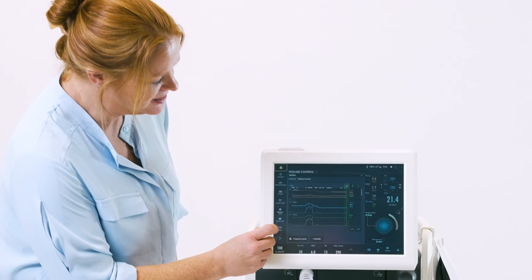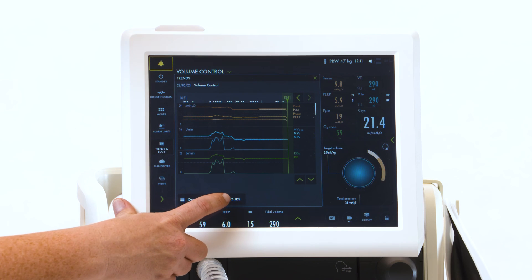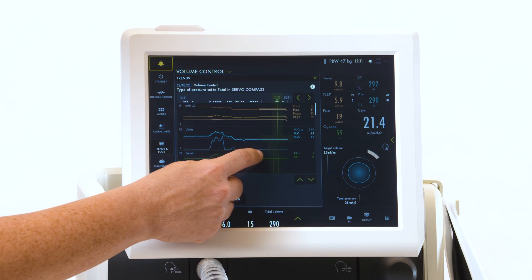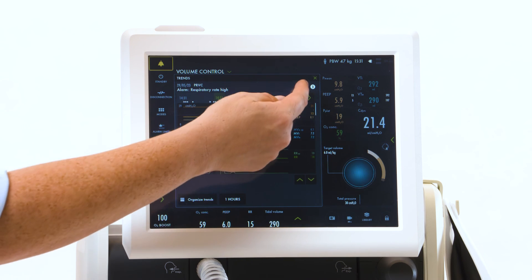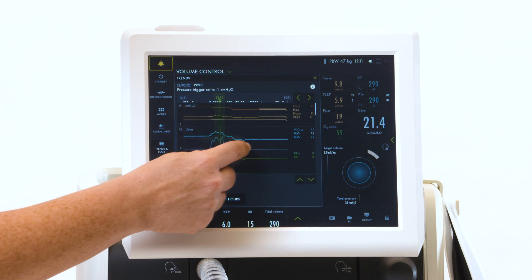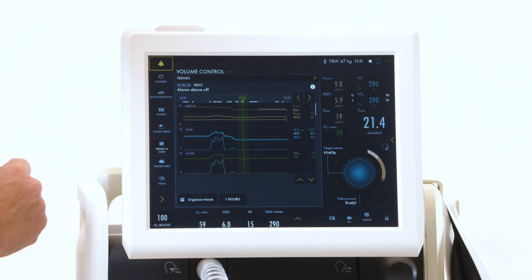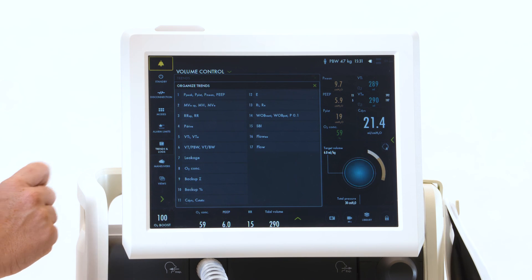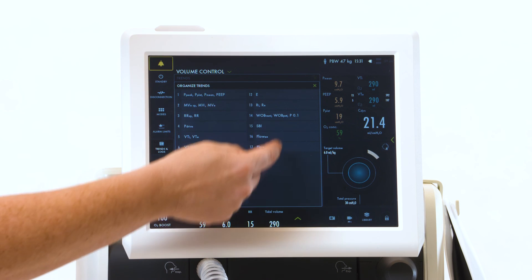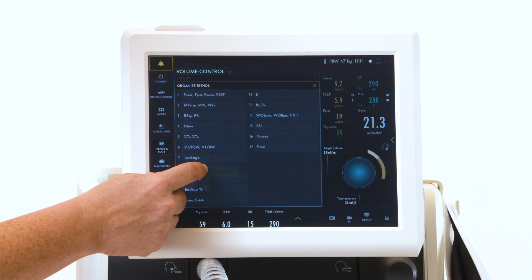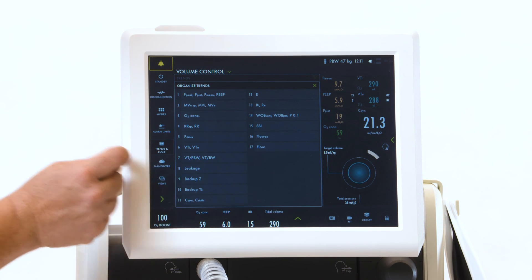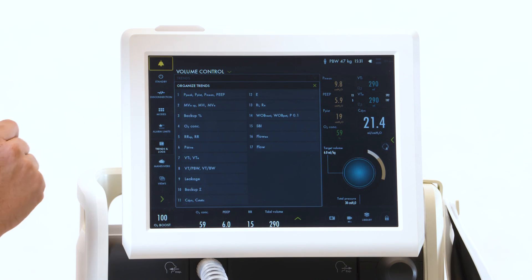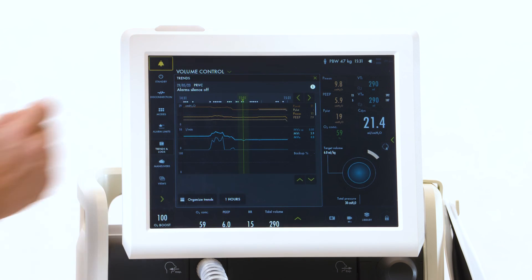When looking at your trends, you can look anywhere from an hour up to 72 hours of time. As you move your cursor, your numbers that appear will be the numbers along that axis. Under here is an organized tab. In order to change the way that they are displayed, touch and drop to change the order. Red X to get out.